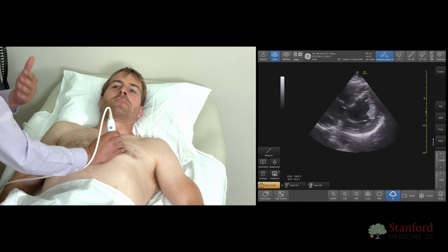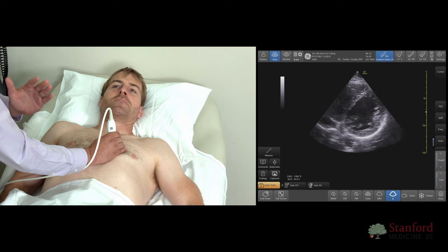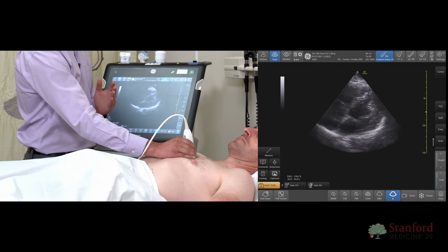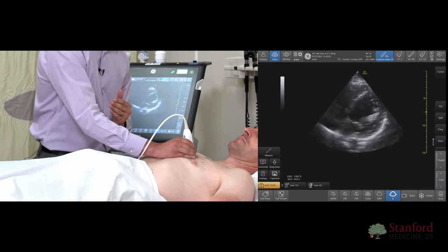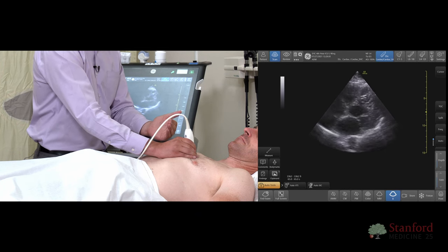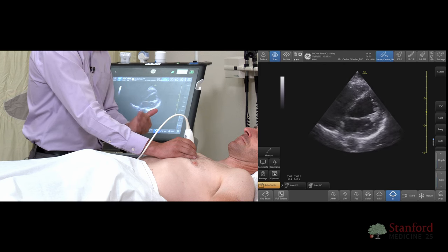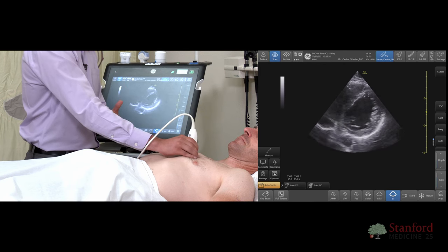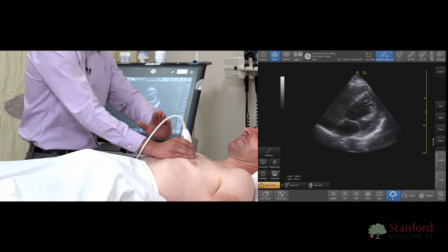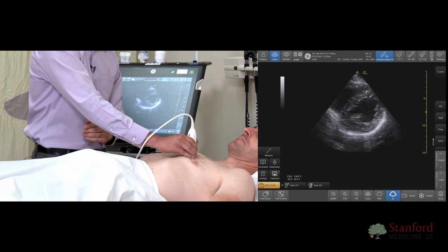Another key aspect of the parasternal short is that it really depends on your probe's angle for what you're going to see. Sometimes you get these hybrid views where you see a little bit of the mitral valve and a little bit of the left ventricular cavity. To adjust for that, just remember that the ultrasound probe is almost like a flashlight — try to imagine what you're pointing it at. If you want to see more of the left ventricular apex, orient your probe more posteriorly, more towards the heart's apex, allowing you to visualize a little bit better.